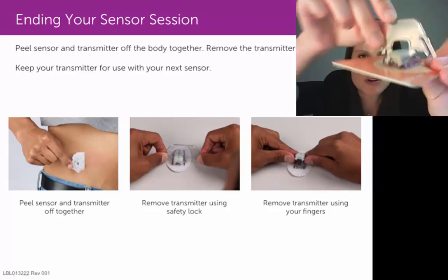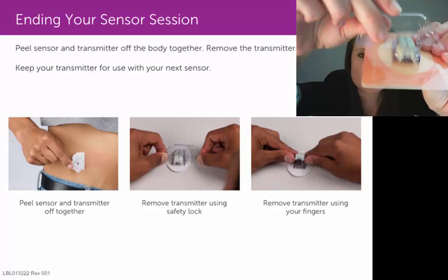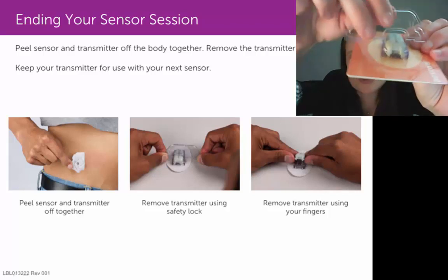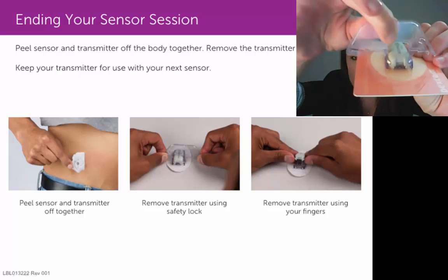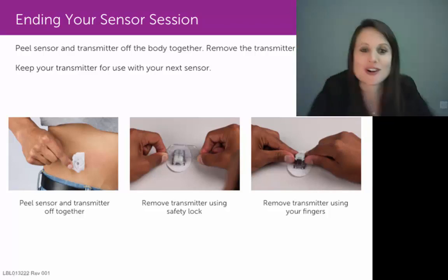Let me show you a few different angles here. The safety lock would need to be perpendicular to that transmitter. You would then apply some downward pressure on that safety lock, and it's a little hard to show you if I'm not on a hard surface.